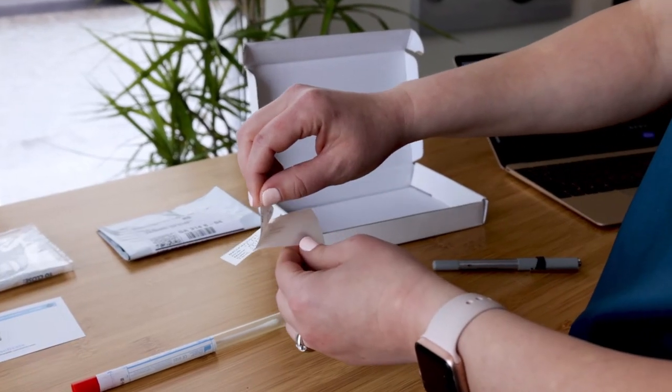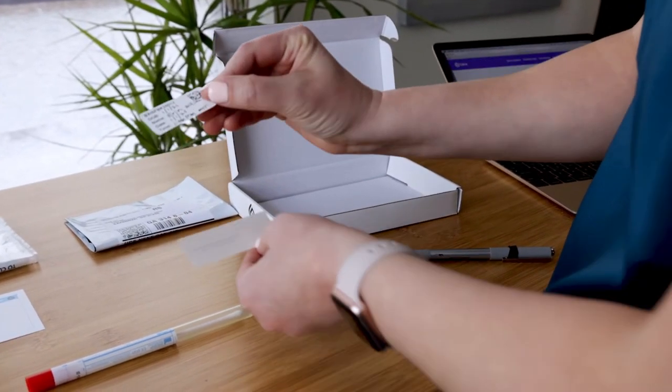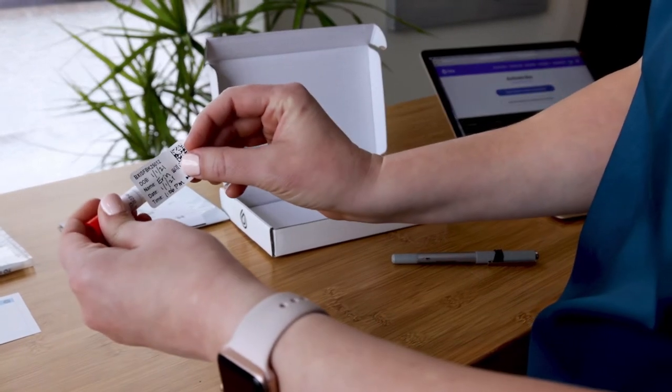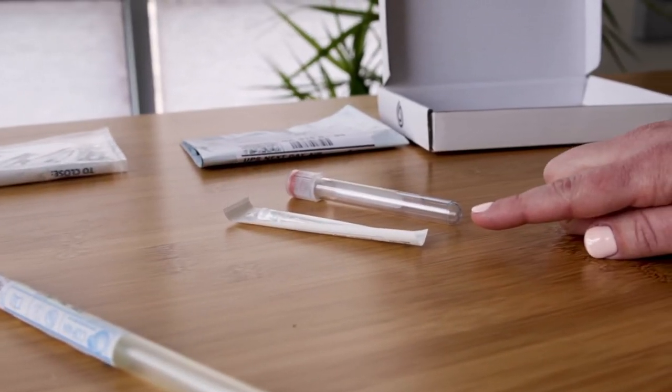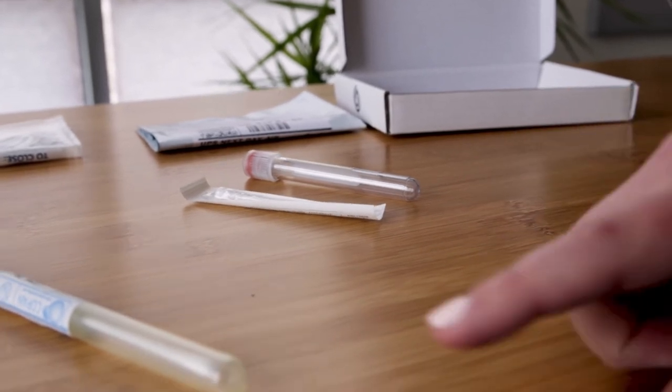In some cases, your identification label may already have your name and date of birth pre-printed. Once you've filled out the label, peel off the backing and place the label around the long side of the swab tube. For nasal swab collection, you may have received either a swab in a peel pouch or a swab inside a tube. Please determine which version you have and set it aside for now.